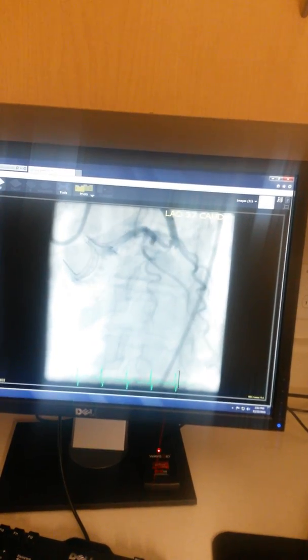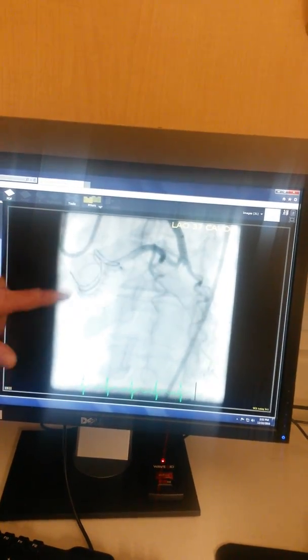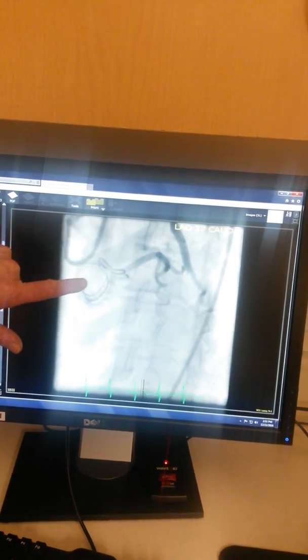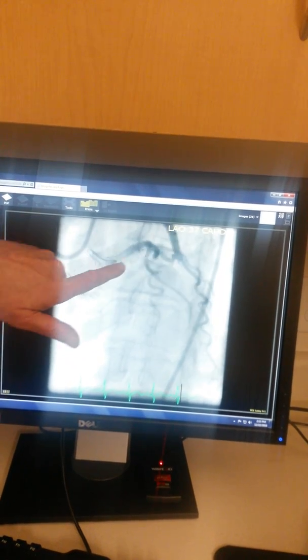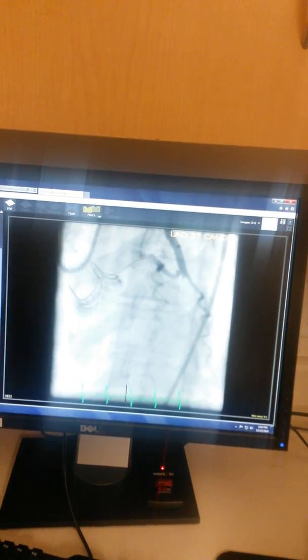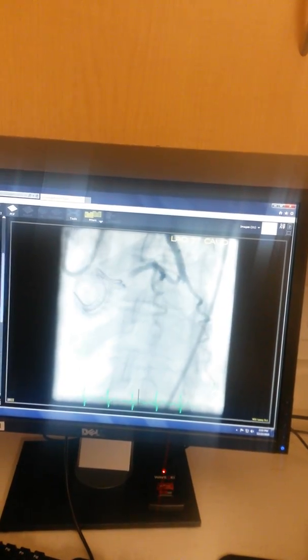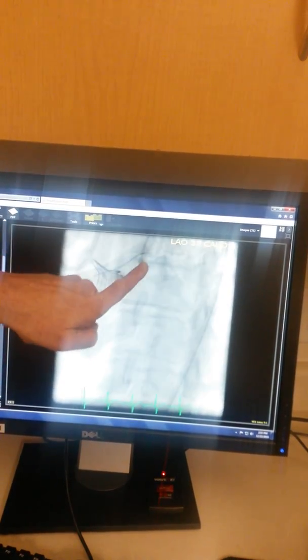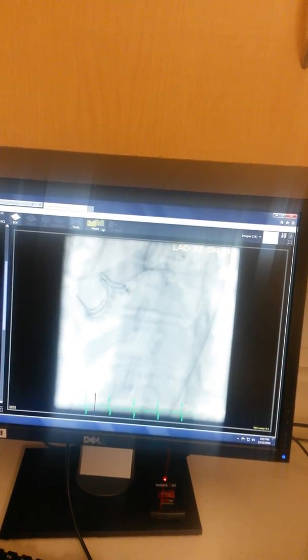This is the first shot after we put the stent in. I pulled the wire back, and this almost certainly is getting popped up by the valve leaflets. You can see at the bottom part how this tapers in a little bit — so even though I expanded that to about 300 pounds per square inch of pressure and it was fully expanded all the way along, it did recoil a little bit. But that's not a big deal.